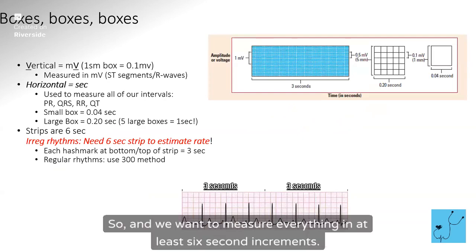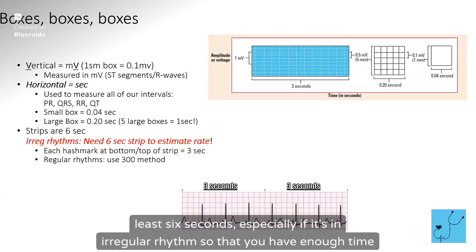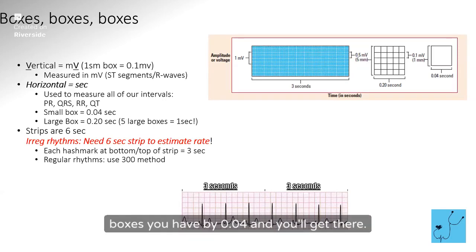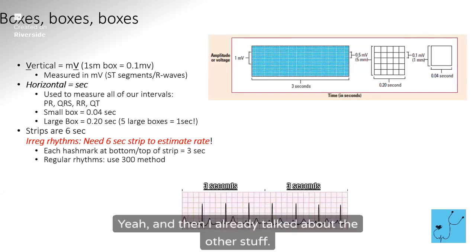Okay, and we want to measure everything in at least 6-second increments. So if you were to print out a strip and measure it and analyze it, you'd want at least 6 seconds, especially if it's an irregular rhythm, so that you have enough time to really see what it's doing. If you remember nothing else, just remember 0.04 and then multiply however many boxes you have by 0.04 and you'll get there. Okay, so that's our measurement. And I already talked about the other stuff.